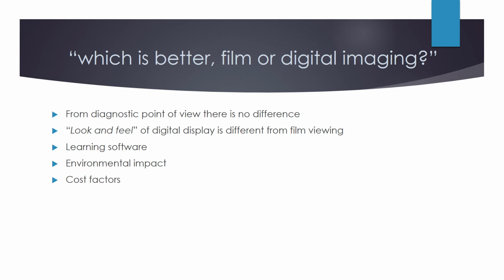Whereas digital images have their own charm. They come with software, which you might have to learn. They have a better environmental impact. You wouldn't have to worry about disposing of chemicals from the processing. Cost factors also have to be taken into consideration. But all in all, I bet digital images are here to stay, and that is the way forward. If you're looking at your own private dental setup, definitely digital imaging is the way forward, and film imaging can have its own setbacks. So it's important that we move ahead and digitize your radiology setup.